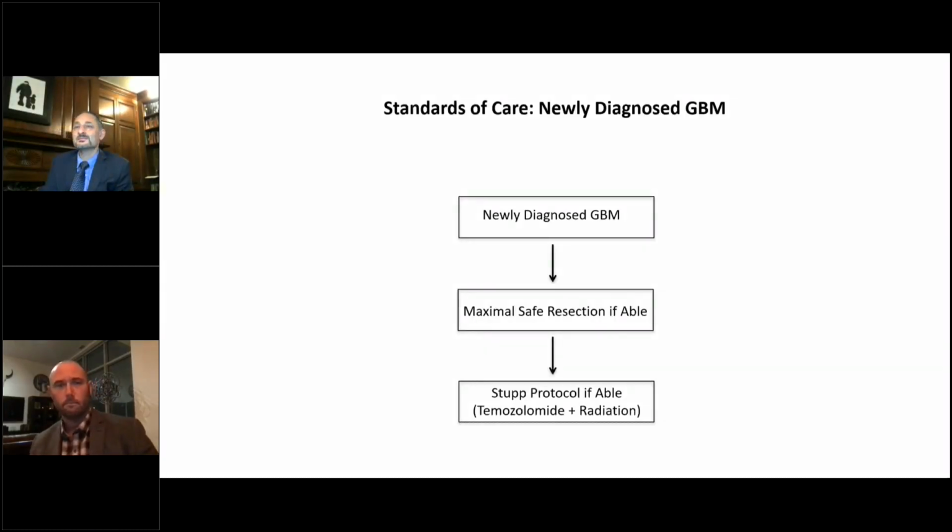Which stereotactic systems can be used for LITT? Yeah, and I'll let Joe Neimat also pipe in as he wants to. We typically use the frameless systems. For instance, we use a VariGuide system, which is the BrainLab system. I think there's Vertek for Medtronic. You could, in theory, try doing something like a CRW frame, but we really tend to use the frameless systems for this, and they work very, very well. Because I want my trajectories to be fairly accurate, and we have certain luxuries available to us where I am, I tend to use an Airo CT to register for BrainLab rather than doing facial recognition, just because that intra-op CT can be super accurate. We fuse that CT with MRI, and then we use the Visualase system as our stereotactic guidance. Joe, do you have anything you want to add to that?